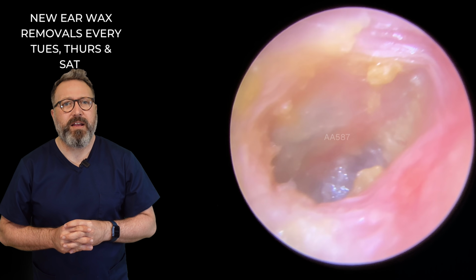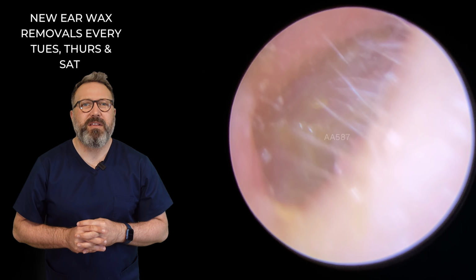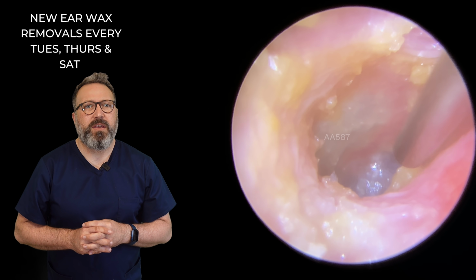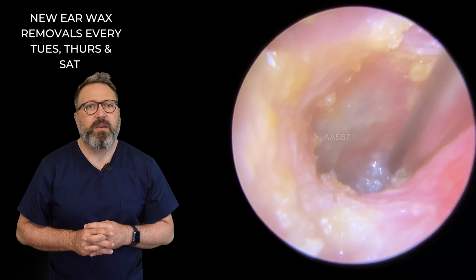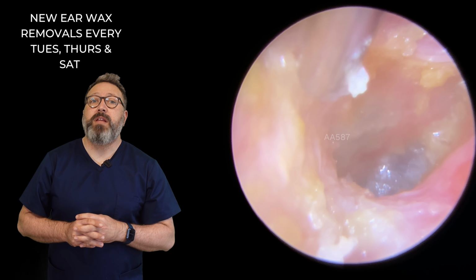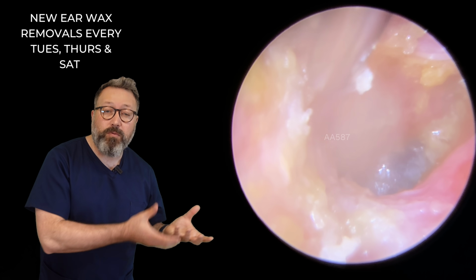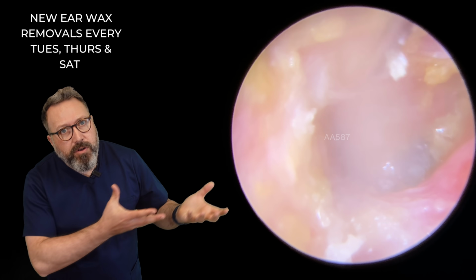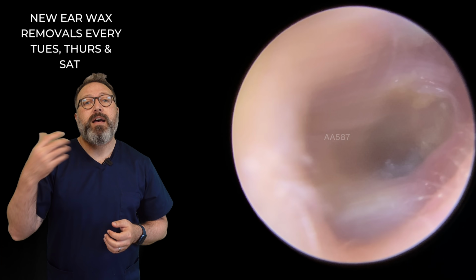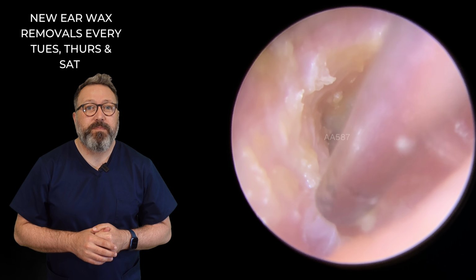Okay, so we're looking a lot better now. I'm having a little look around there with the endoscope. Let's just take this section away here. There we go. So what will happen is, now we've got rid of the foreign object, that natural migration process, that conveyor belt we talk about all the time with the skin, is going to be reinstated. It'll all be moving out towards the outer part of the ear canal, and then it's going to just fall out, or be picked up with a little bit of wax.